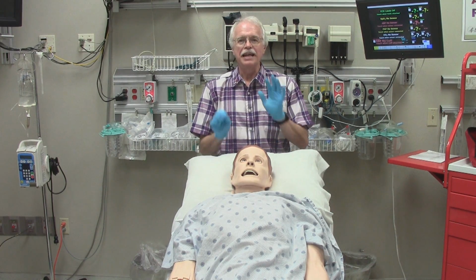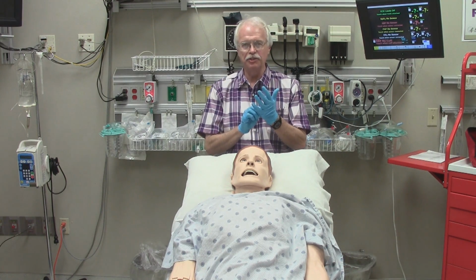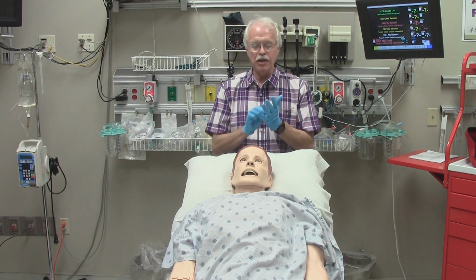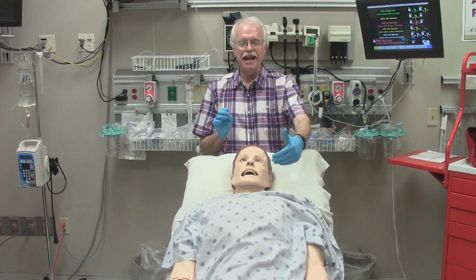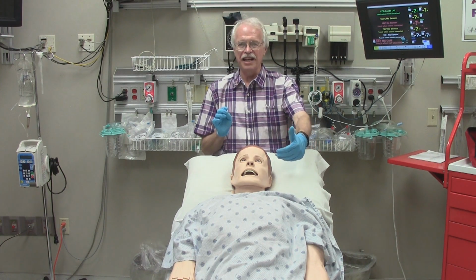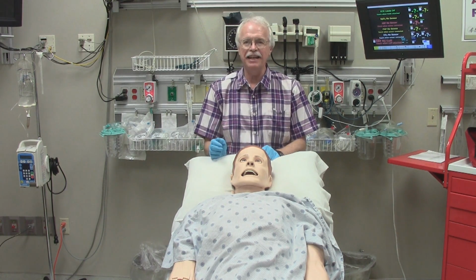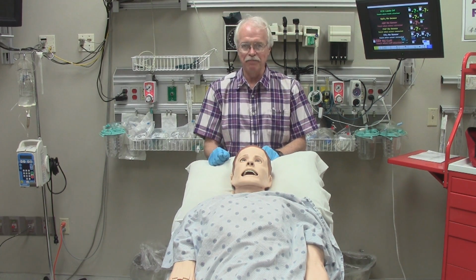If you have begun to pick up the habit of writing notes on your gloves when you work, for charting information about the patient later, please don't do that here. If you write your notes on your glove and then forget and touch the mannequin, you can tattoo the vital signs you just charted on your glove onto the mannequin's skin. Also, please do not lay photocopied material of any kind down against the mannequin. Photocopy ink also can transfer onto the mannequins and stain them.